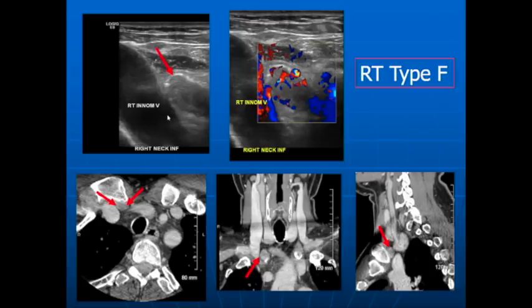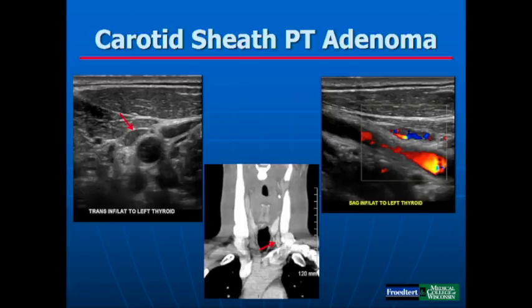So this patient can extend the neck very well, but the sonographer also has to be careful when looking at these patients. One of the important things to mention is the location of these glands. When doing ultrasound, it's important to have deeper portions visualized and have good landmarks to get the correct localization. Otherwise, use clips, and sometimes even a lower frequency transducer.